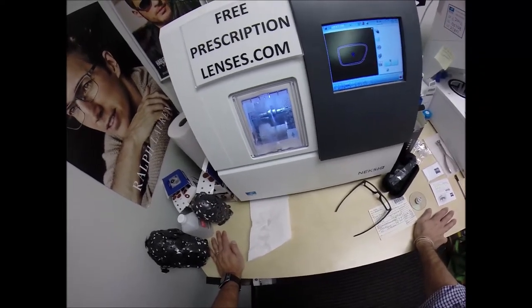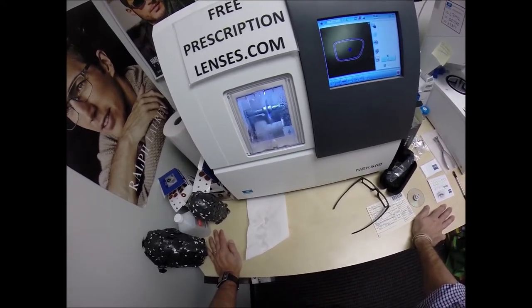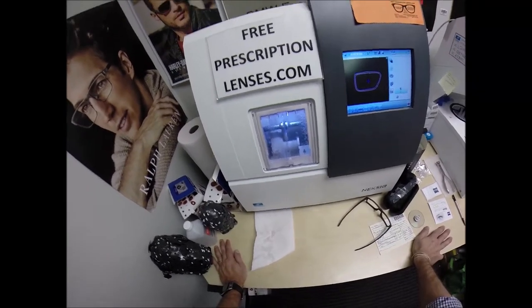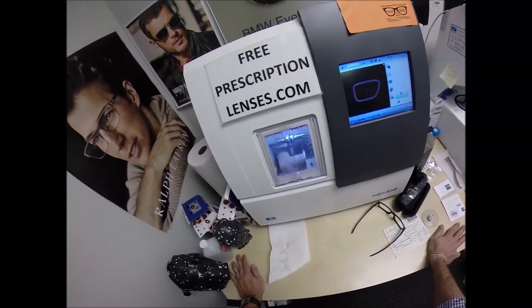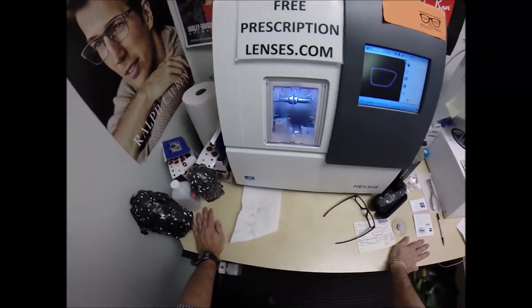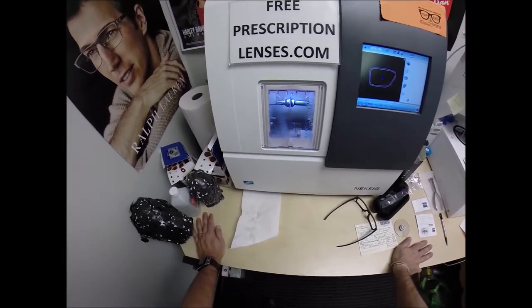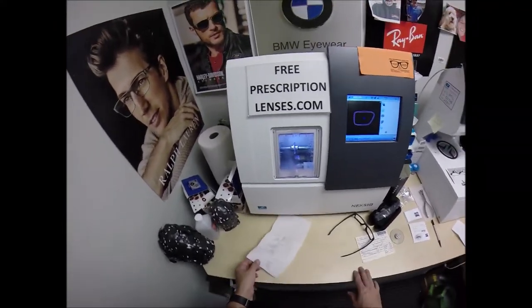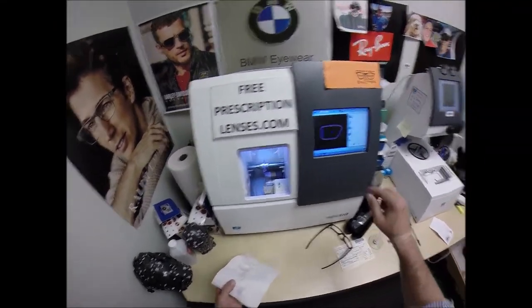I'm going to slowly add all of the Zeiss lenses onto the website. All of their progressives. This is the house brand, the Light D. They also have the Light H and the Light V, which is comparable to the Verilux X. And then they take things to another level — they have the Zeiss branded lenses, the Individual and the Individual 2.